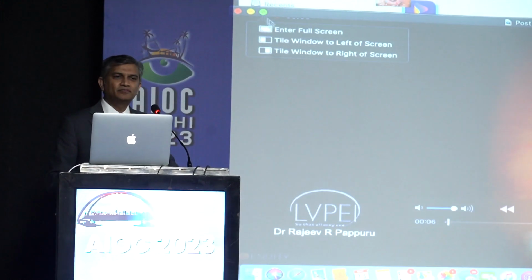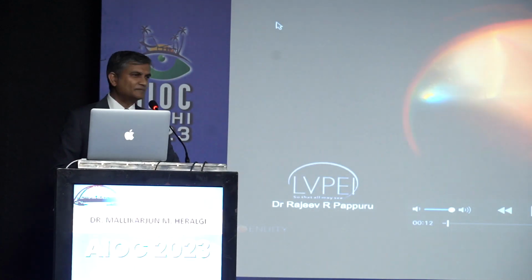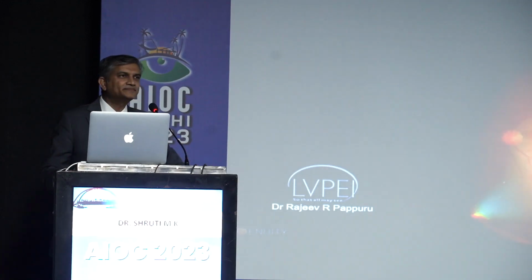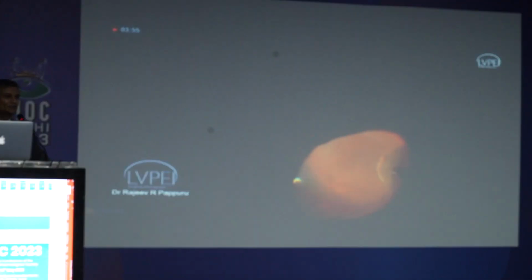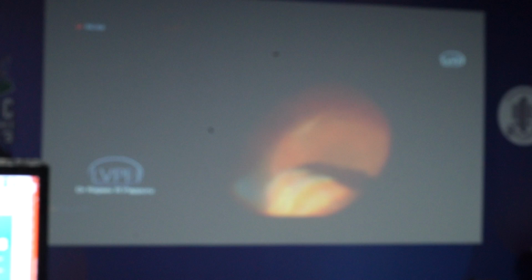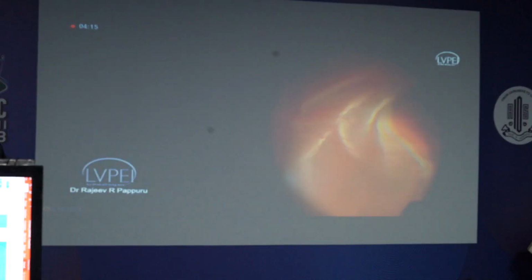So this is a patient where we had done a GRT, actually a vitreous surgery. It was all good, the retina was attached, we removed the oil, and he was okay for a month, then came back after one month saying that he has a little distortion of vision. So then we looked inside. That's the edge of the retinotomy, the GRT where we had done laser. The whole temporal side till 6 o'clock was the retinotomy.